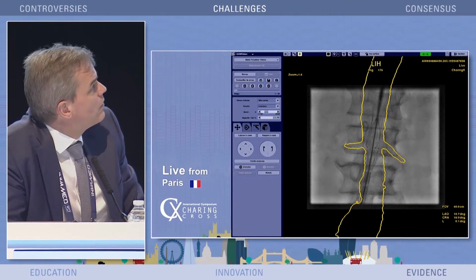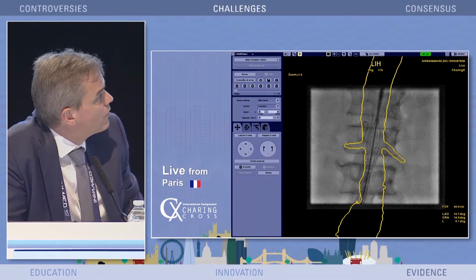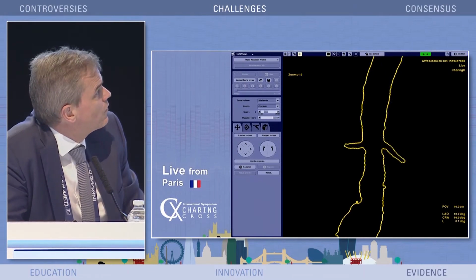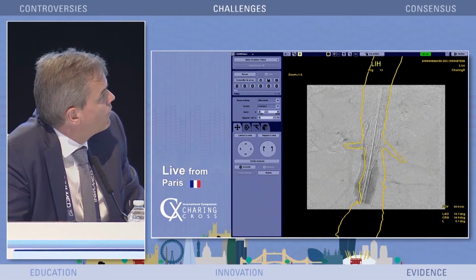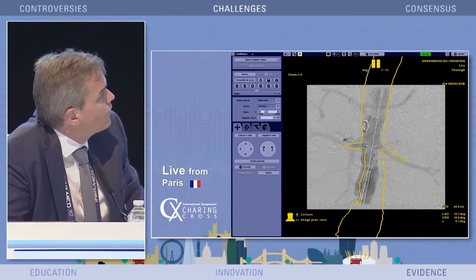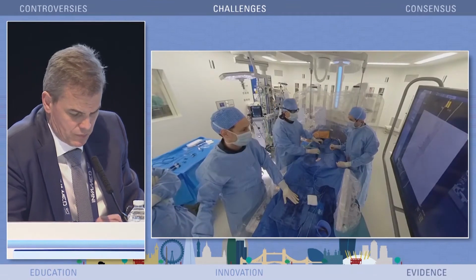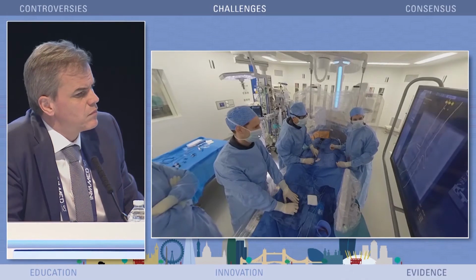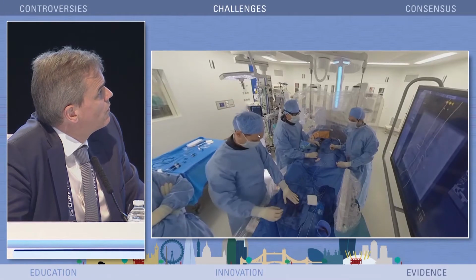And I'm going to shoot a new angio to check if the graft is in the right position. A breath hold, please? Okay, thank you. He can breathe? So obviously I'm slightly too high here. Well, not really too high, but I don't need to be sharp just below the renals. You remember he has a long neck. So I'm getting the device slightly down here. And now I'm happy with the position.